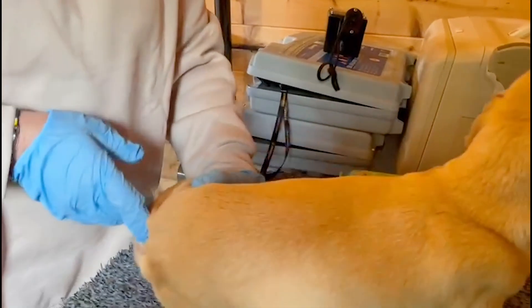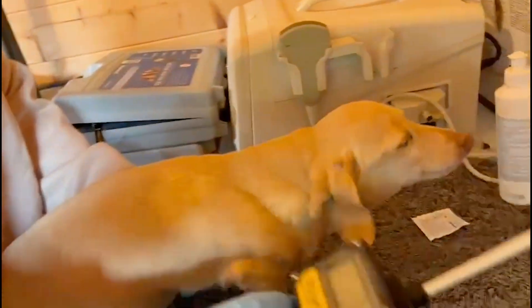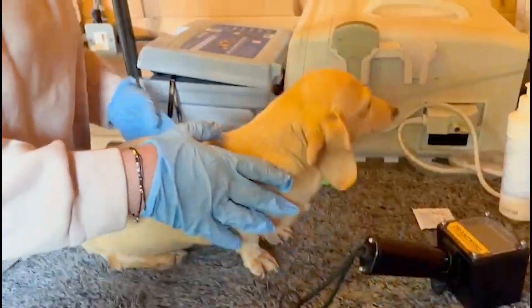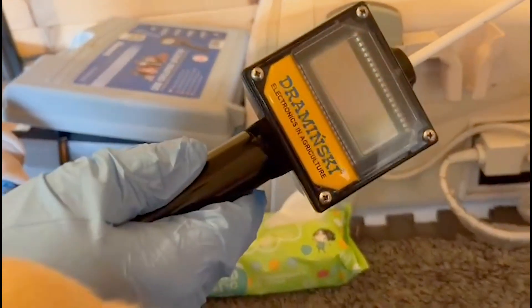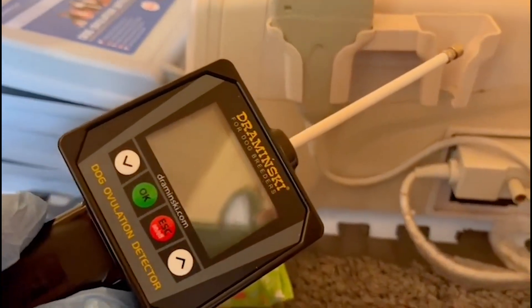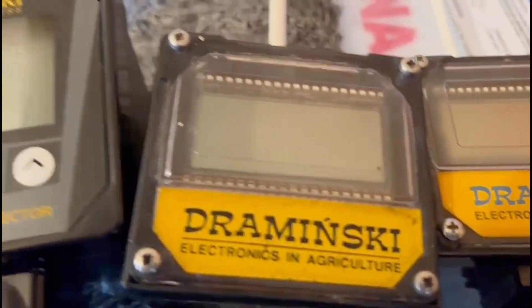We're doing this video to show you how the Draminsky works. We have been using Draminskys for probably 15 years. This is the Drod Ovulation Tester — our eldest one — and then we've got another one, our second eldest, and then the youngest model, which is called the DOT 2, which is very exciting because you can store data and do all different things with it.